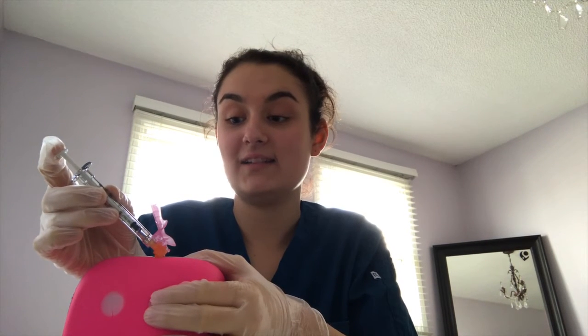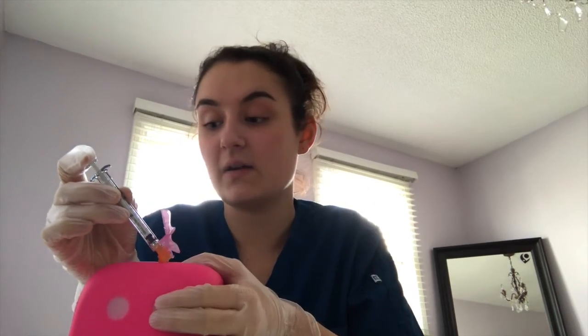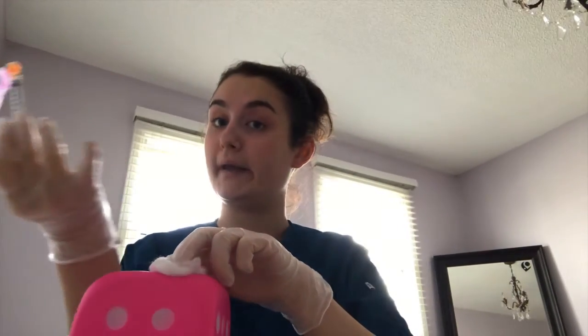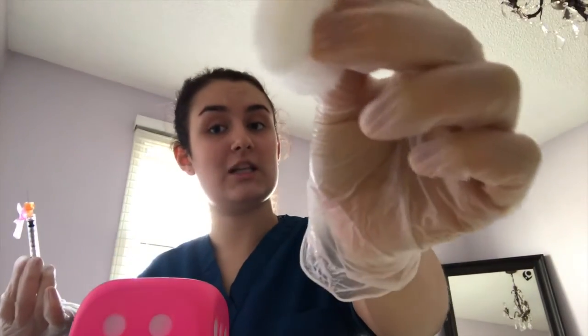And we're in. And we're injecting. This is good. This is going well. And we're taking out and pressing. Okay, we're pressing because we're stopping bleeding. And again, dispose in proper containers, sharps, garbage or biohazardous waste depending on the patient. Know what's in their blood, people. If they have a blood infection, maybe don't put it in the garbage. And poof, the injection is done. You've completed it. What do you do now?